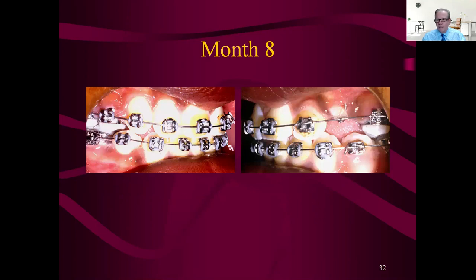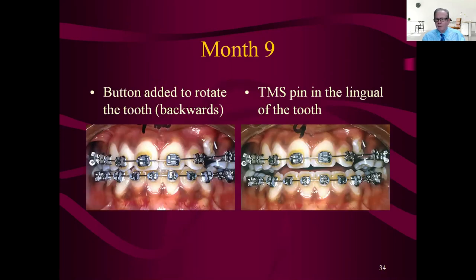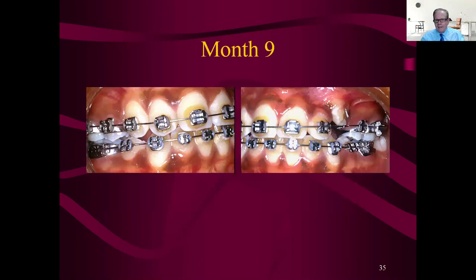Now we get some enamel in the arch. You can see where that TMS pin was — it looks like it was cut off. We got a button on some surface. Remember, you want to pull as much enamel as you can into the arch and then put as many things as you can on it to derotate it. The TMS pin was put right in the lingual, right where a little pulp horn is. In cuspids the lingual pulp horn can be pronounced — so that pin went right into the pulp chamber, which is going to be a problem. You grab it and unscrew it with the little wrench provided.